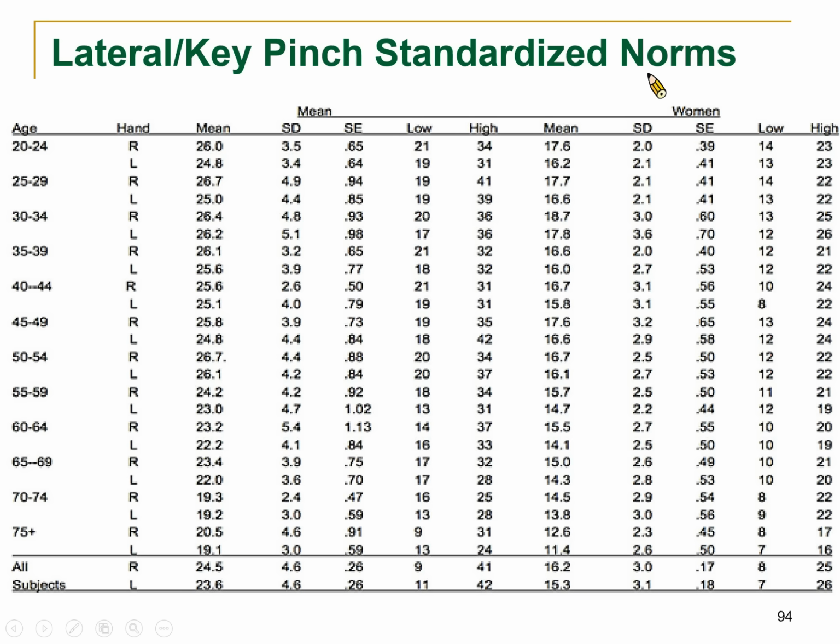OK, 大家可以对照这个表，看看你的这个 lateral pinch，好，就是这个捏力的这个东西是不是在正确的范围里面，好不好？The number is in pounds or in kilograms? Let us see. Pounds. This one is pounds.